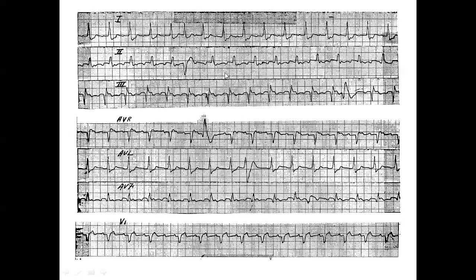When I walk down the hallway, I know you will call me, oh, there goes Dr. Wang. So you can say, oh, there's an atrial flutter here. Yeah, it is an atrial flutter. Whenever anything looks like that, so slow, slanting down, why could this not be just inverted P, inverted P, inverted P? Well, then this will not slant down. It will be horizontal. It will be straight, not slanting down. Yeah, you can look at it a little while and become familiar with it.